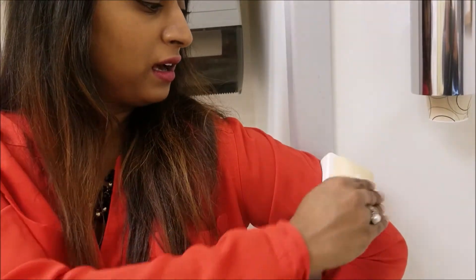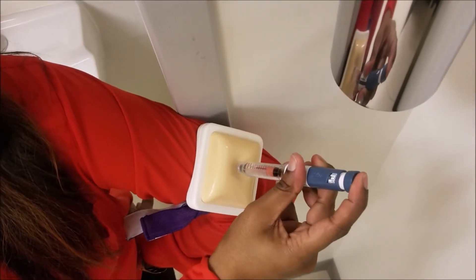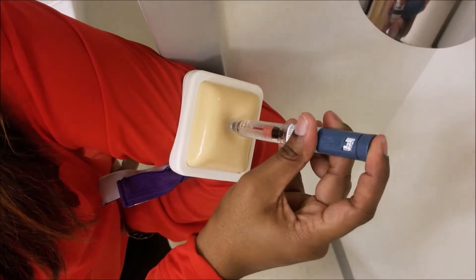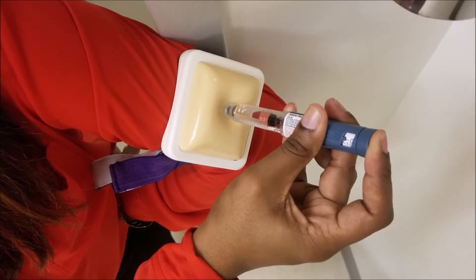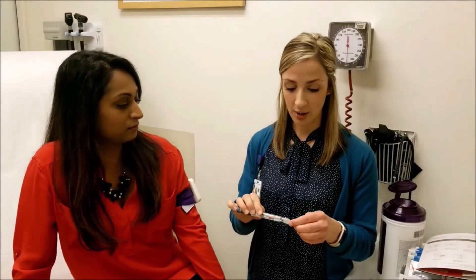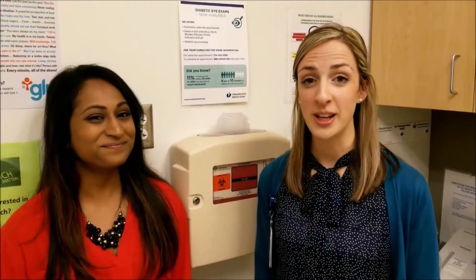Make sure you clean it with an alcohol pad. Push the needle into your skin, and press down on the dial while the window is facing you, making sure that all of the units have been administered and it goes down to zero, and hold an extra five seconds. Then remove. Locate the big cap from the beginning, and push and twist to remove the needle. Now you know the basics of using an insulin pen.